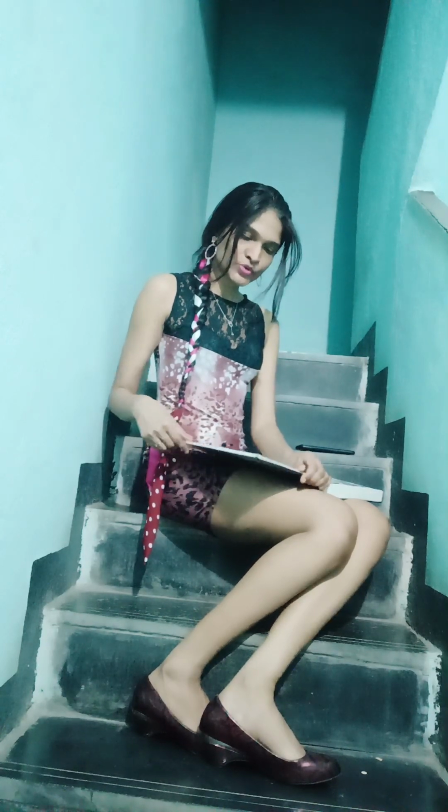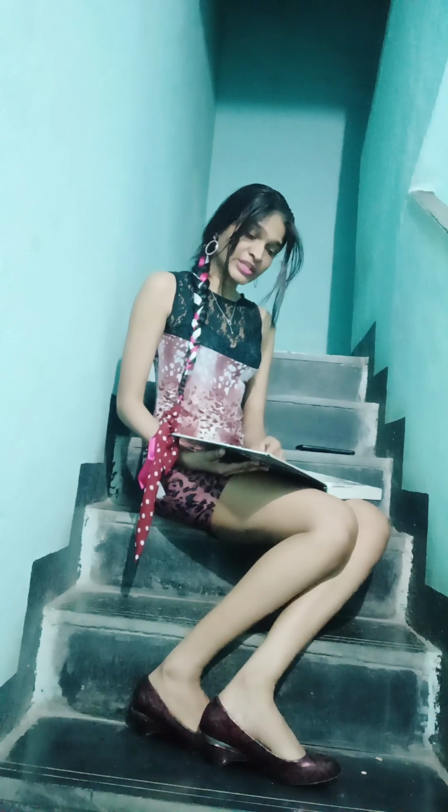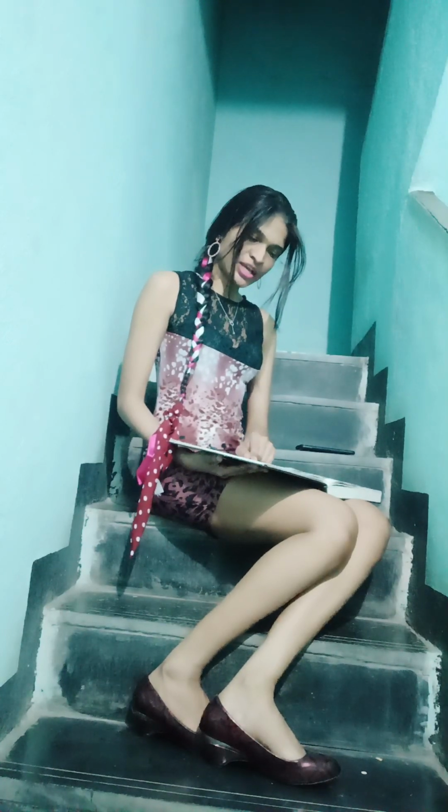Then comparison of direct and indirect gonioscopy. There is no unanimity of opinion on which basic method of gonioscopy is best. With direct gonioscopy, the height of the observer may be changed to look deeper into a narrow angle, whereas the gonio prism is limited in this regard by the height of the mirror. In addition, the gonio lens may cause less distortion of the anterior chamber. Both features make it desirable when assessing the true depth of the anterior chamber angle.